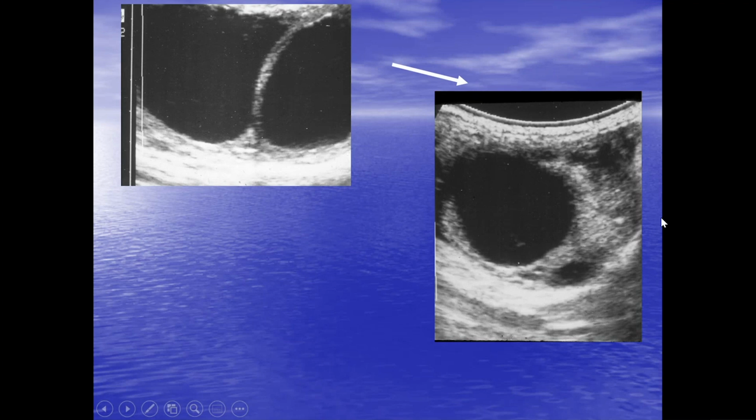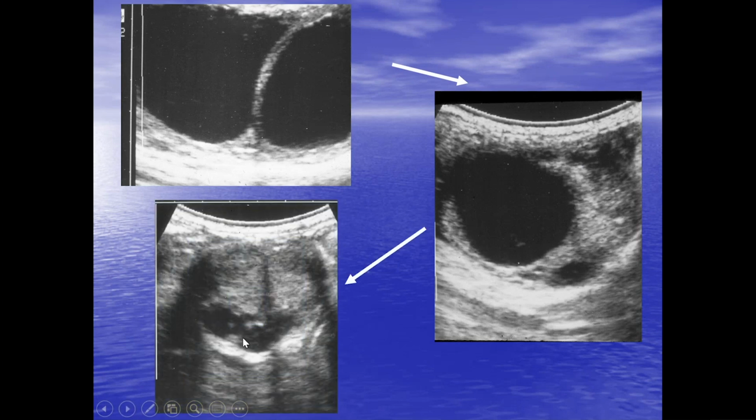It can be difficult to detect the very fresh ovulation. It hasn't really had time to organize, form an obvious corpus luteum. But there you can see it, an indistinct structure. And then if we went back the following day to this mare, a bit more obvious. We can see there we've got the 2 corpora lutea.